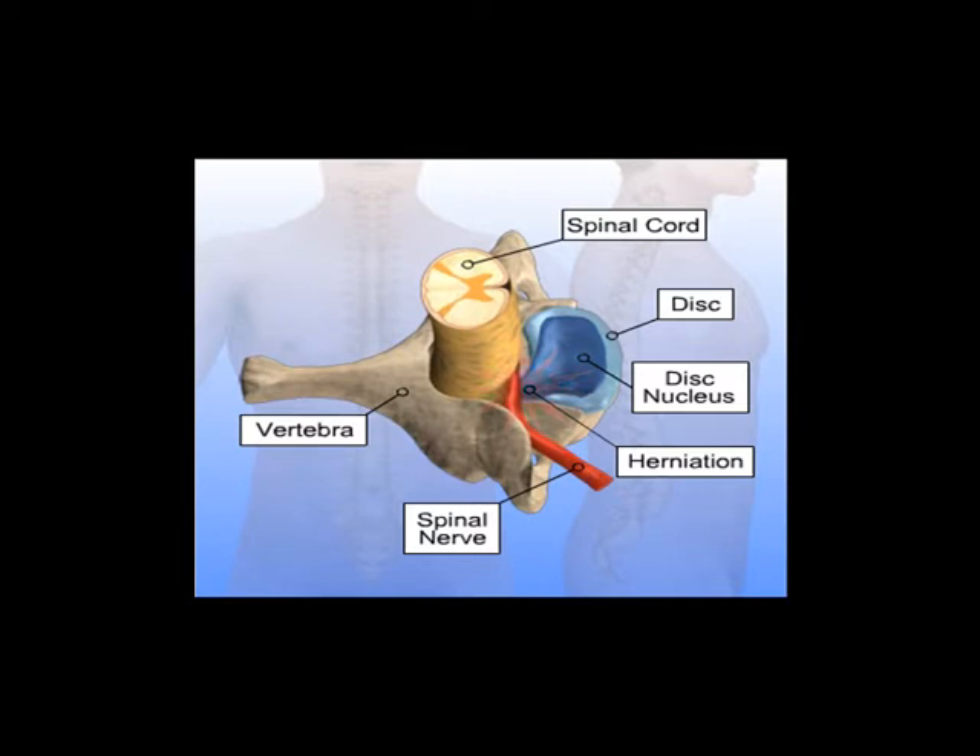A bone graft is usually inserted with instrumentation to keep the disc space at a normal height and fuse the vertebrae above and below the removed disc.